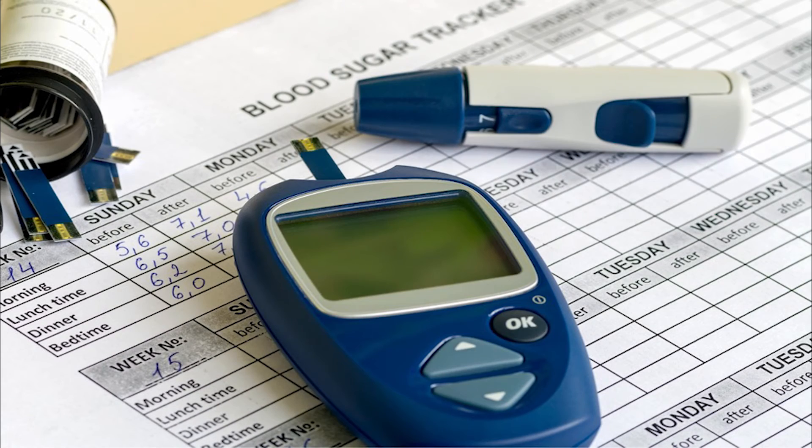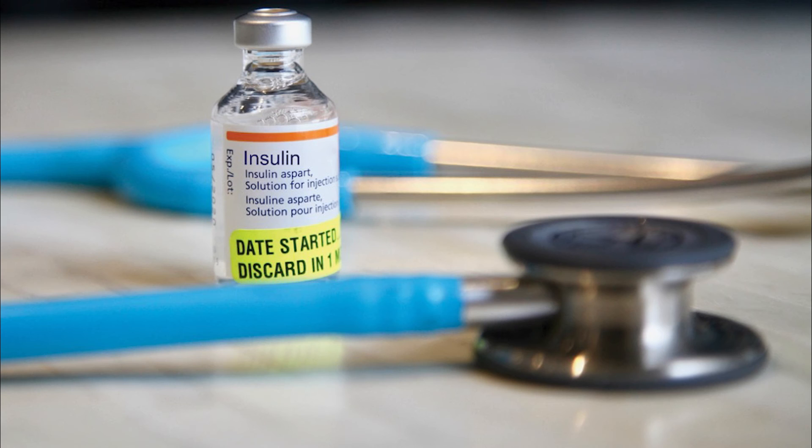Always follow your healthcare team's instructions on when to check your blood sugar. Blood sugar is typically tested before breakfast, before lunch, before dinner, and at bedtime. People taking insulin injections or using an insulin pump will test several times a day. Those taking pills usually check less often.